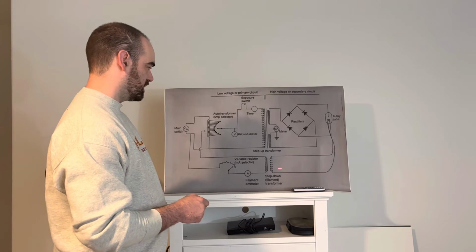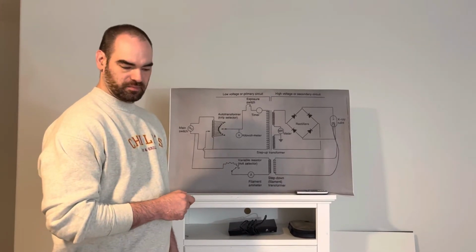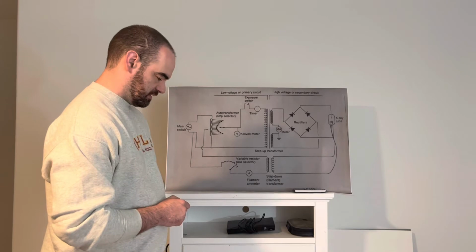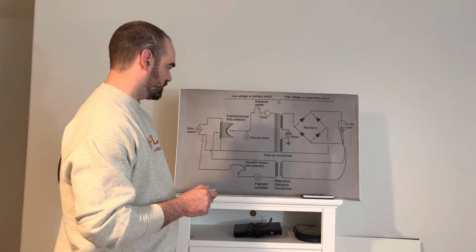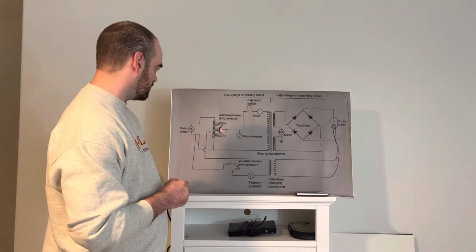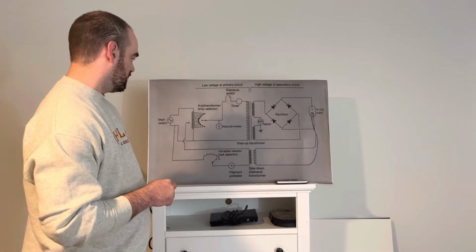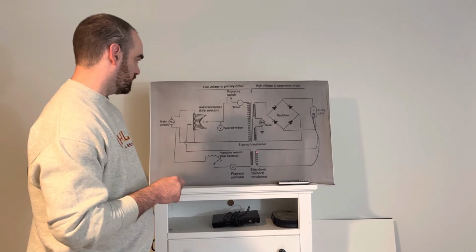On this side of the filament, it will have, I believe, 3 to 5 amperes and 5 to 6 volts. And that will go to the X-ray tube. And the 5 points of induction are here, here, here, here, and here. 1, 2, 3, 4, 5.